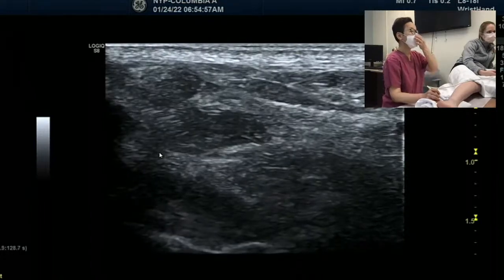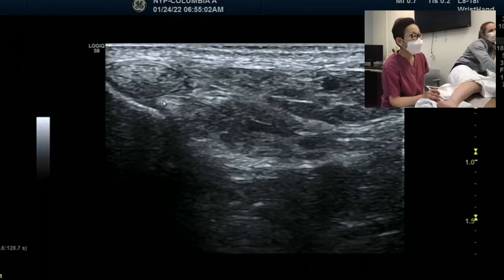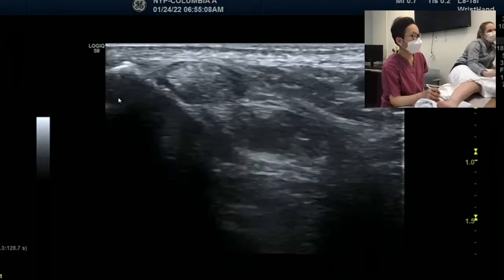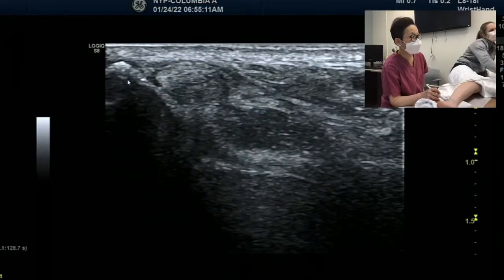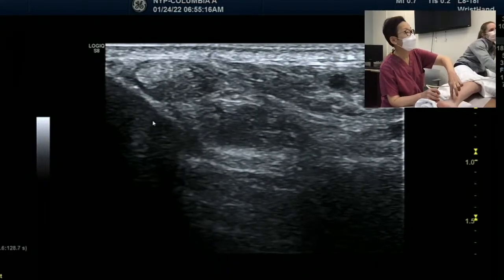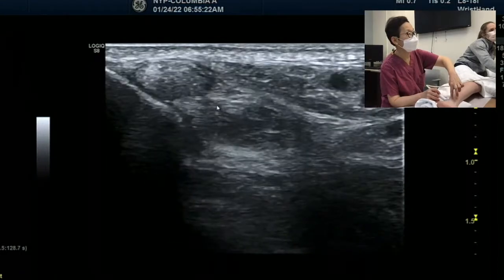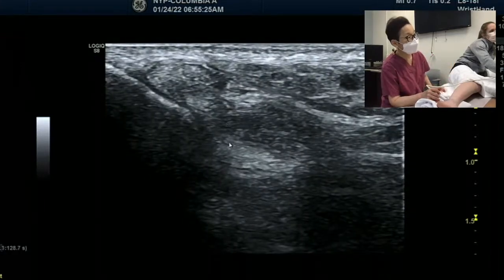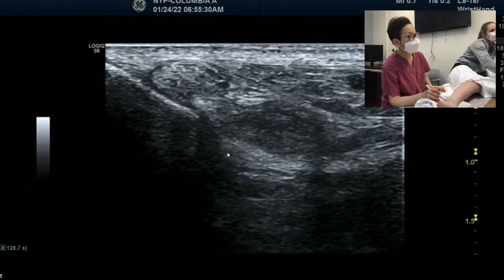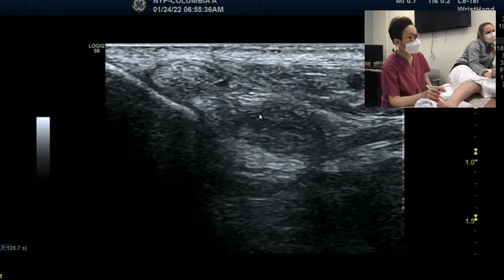at the ankle joint. So, as you know, peroneus longus and brevis, you can see on the top left side. Let's orient ourselves. On the left of the screen, the bone shadow is the lateral malleolus. Then there are two muscles you can see. The bigger one below is peroneus brevis, and on the top is the peroneus longus tendon. Brevis is more muscle; the texture is different, right? So peroneus longus starts first, then peroneus brevis.